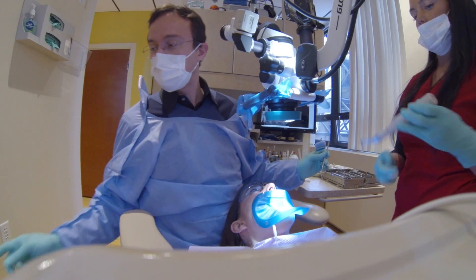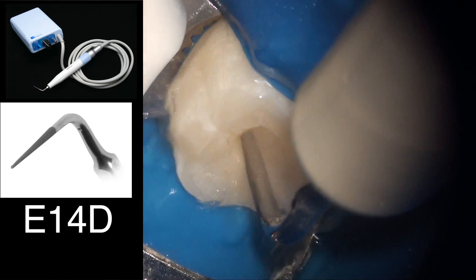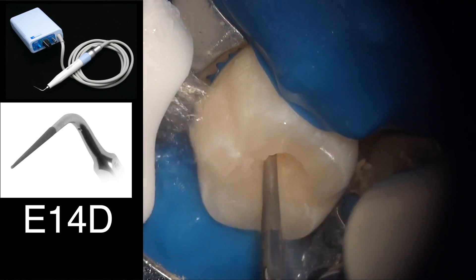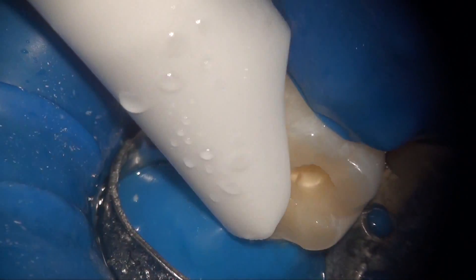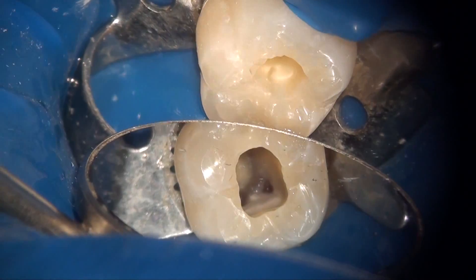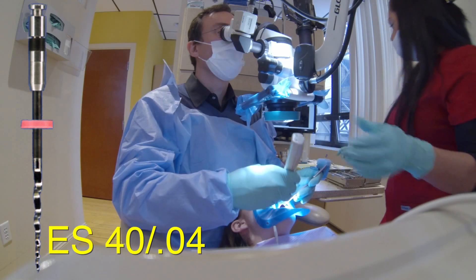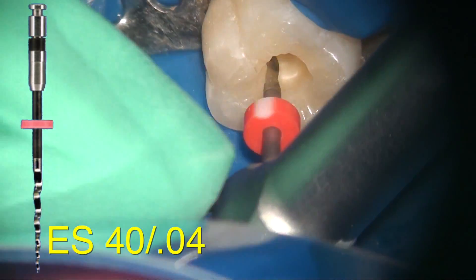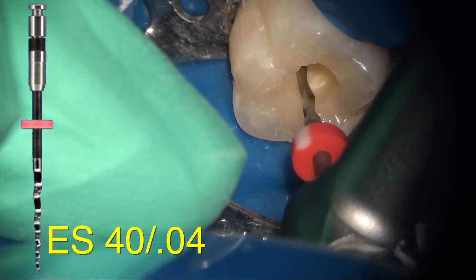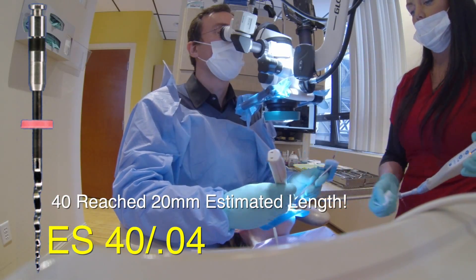Please pay attention that I'm using the ultrasonic and water in a very deliberate and constant way, because I'm using water as my main irrigant for the first half of instrumentation. The combination of water and ultrasonic is the most efficient way to remove the gross debris generated during this early phase. I'm beginning instrumentation with the first EndoSequence file, which is a size 40. The EndoSequence instrumentation is crown-down, so we go from largest to smallest using passes of three — one, two, three — then take the file out.